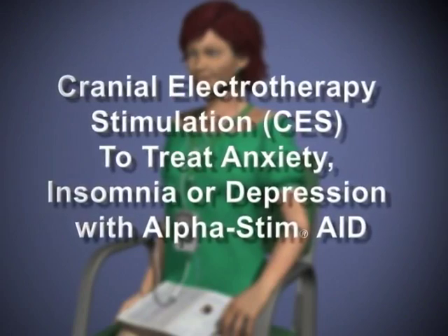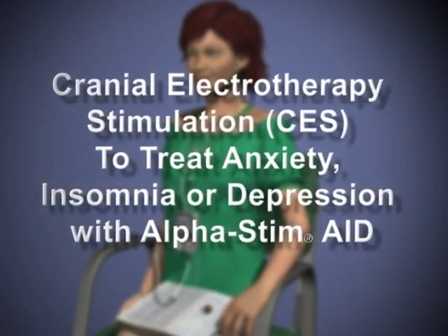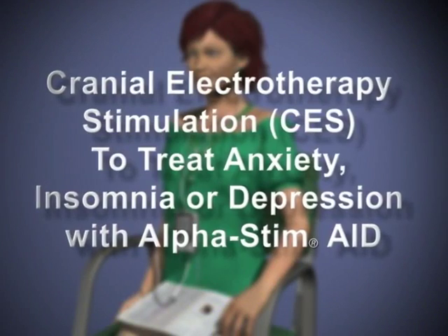Cranial electrotherapy stimulation to treat anxiety, insomnia, or depression with ear clip electrodes.